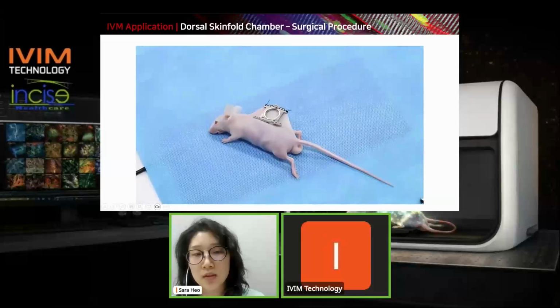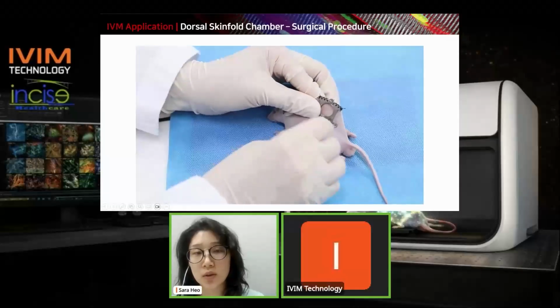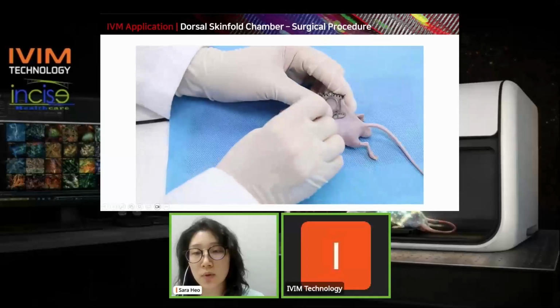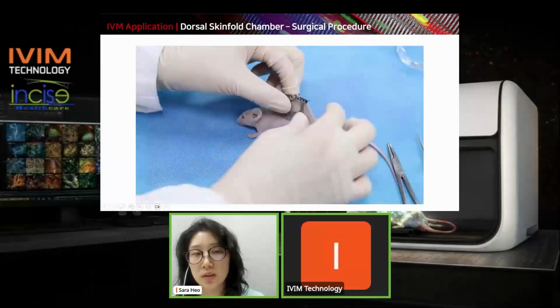One by one. Then that's the result of the surgery. And then there's the other two sides at the bottom of the frame that are going to be punctured the same way as the first one. So it's going to do puncture, and the screw and the bolts are going to be used to secure the frames and skin in a different place.